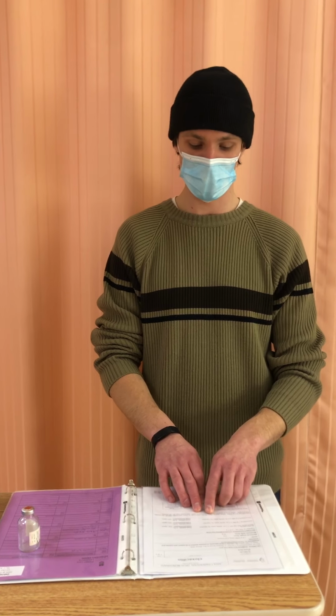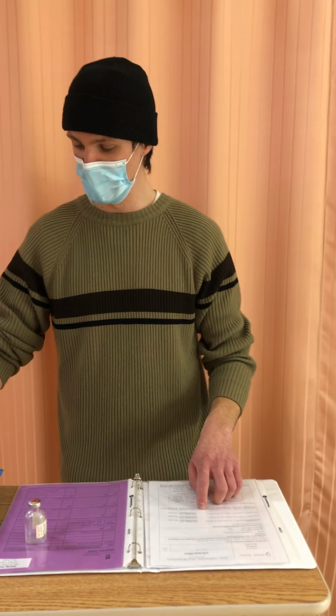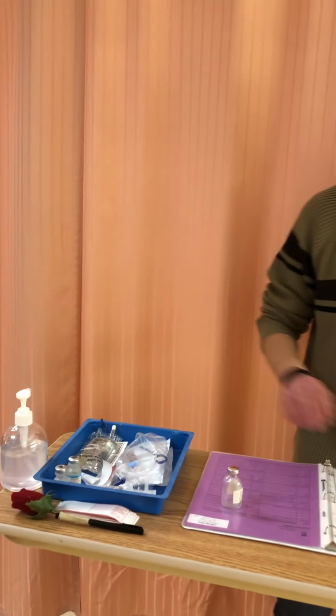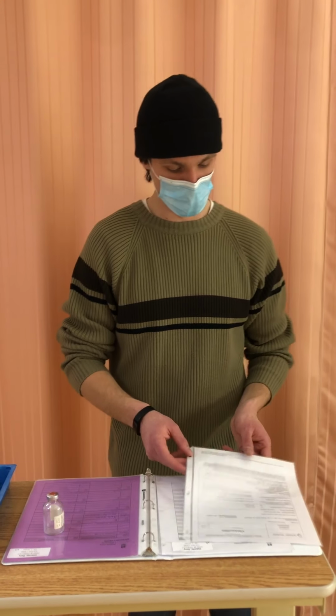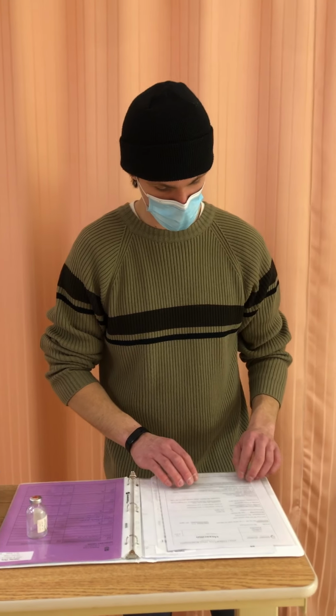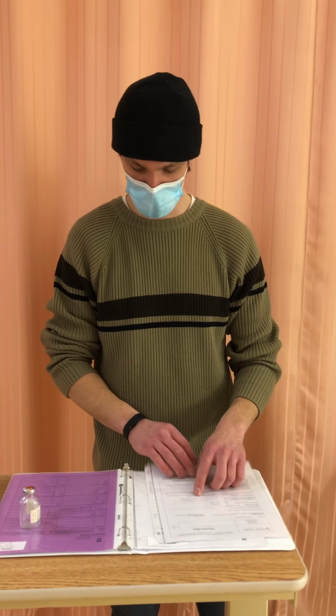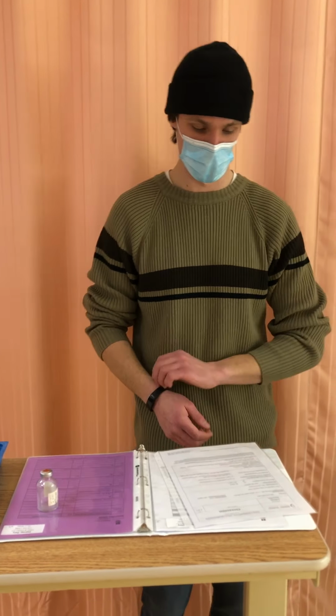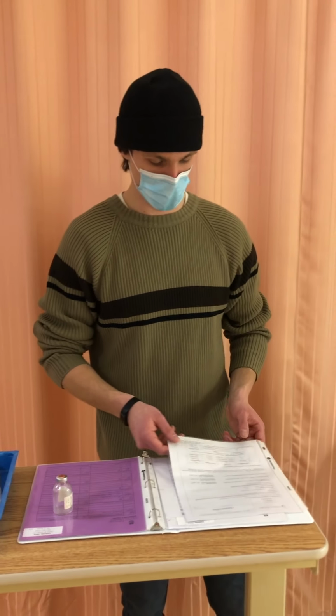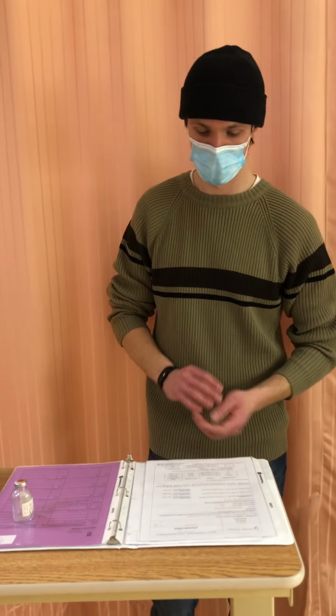It should be diluted in 50 to 100 milliliters of normal saline. I have 100 milliliters of normal saline here, and it should be administered over 30 to 60 minutes. I also note that it is compatible with normal saline, which she has running at 25 milliliters an hour already. That's her primary infusion right now. So now I can go ahead and begin to prepare the medication.